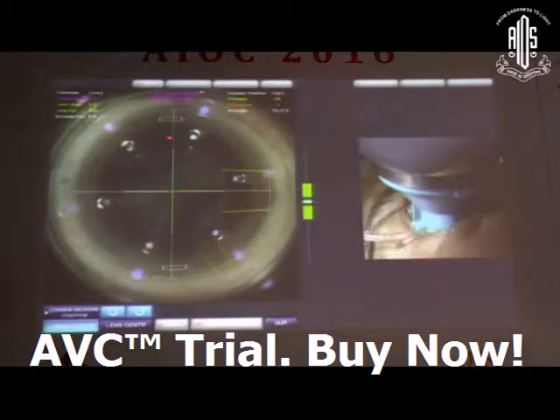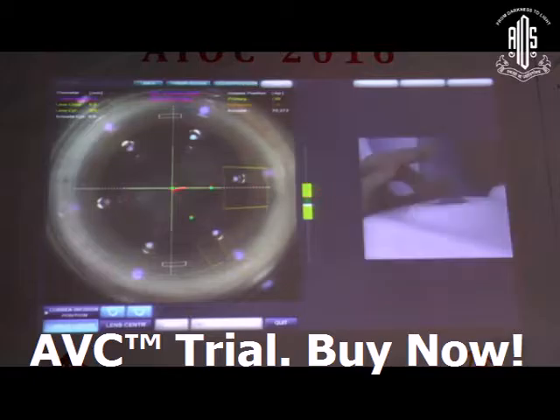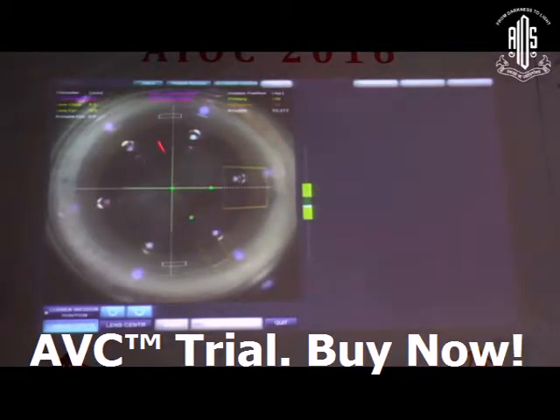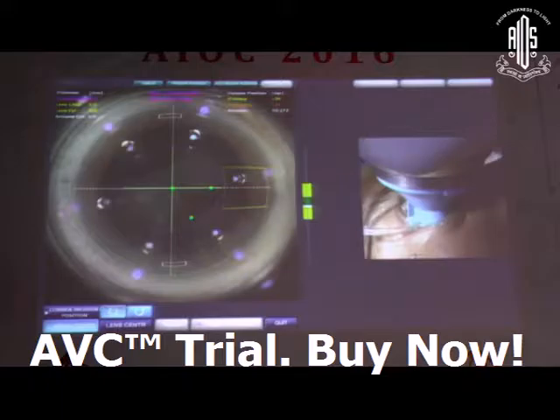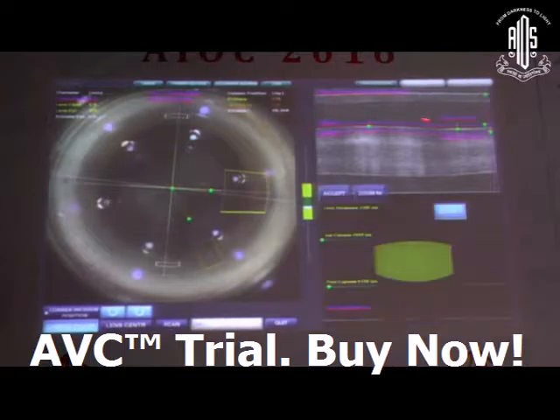This is the mark for a toric lens, wherein instead of putting a mark, you can make intrastromal marks in the cornea. This is the docking that is being done. Once you have it at the green ring, you can center it, and this is a 4-quadrant split that you will have. This is a cyclorotation. You can see that with the mark there was a slight cyclorotation on docking, so we are cyclorotating so that the axis is perfect as you want. This has been docked.